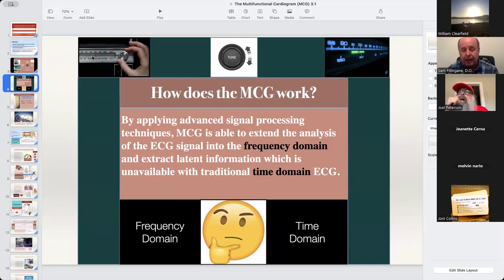And the same thing happens with electricity. These electricity signals are telling us something different at each frequency. And over a period of years, this cardiologist was able to associate what each bar code meant for each part of the heart. And it became a passion.